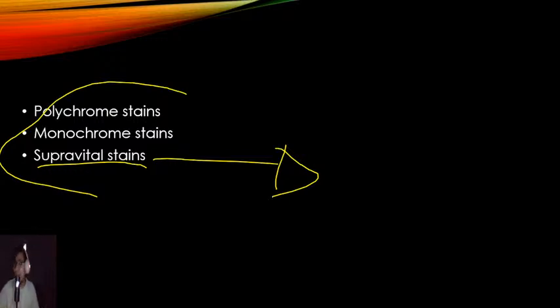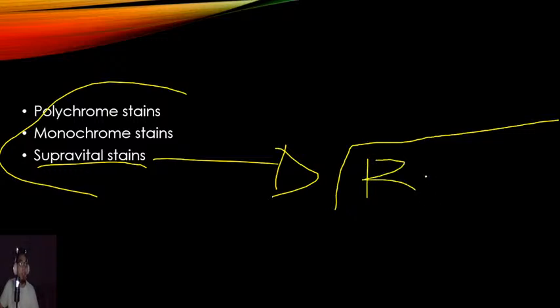BCB. What are we looking for when we stain your bloods? Yesterday, sinabi ko yon. Maturation series. Reticulocyte po. Yeah? Another term for reticulocyte. Anybody aside? Thank you, Joanna. What's another name for your reticulocytes or retics?